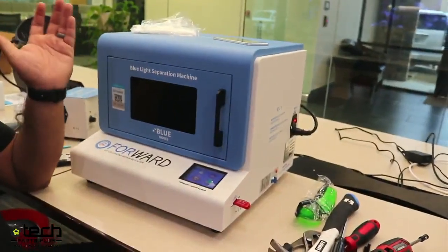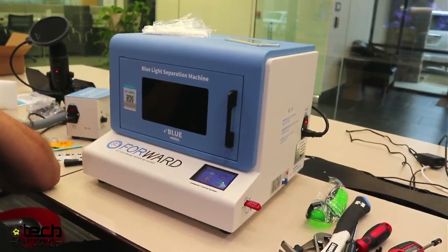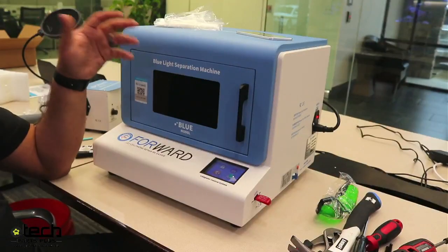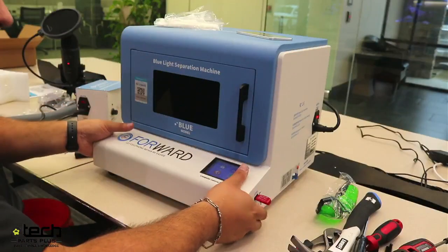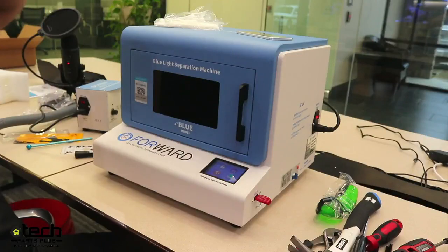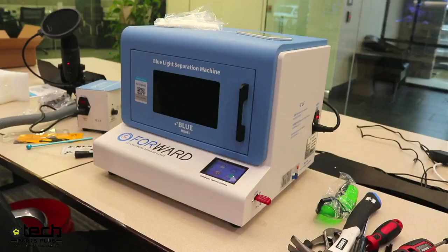Do I need to calibrate the machine after a certain amount of time? No. Time isn't the variable that affects calibration — movement does. Not the internal machine moving, but physically picking it up and moving it somewhere else. If you bump the machine, that's what causes calibration to change. So if you don't bump it and keep it in one stationary spot, there's no reason to redo calibration.